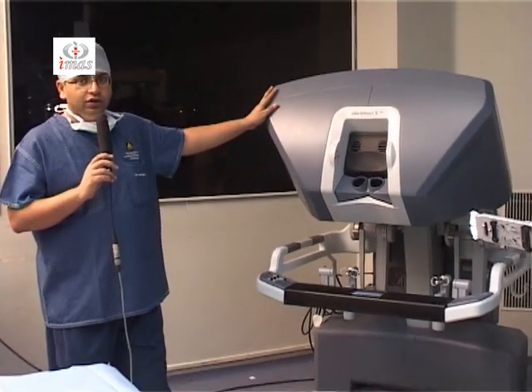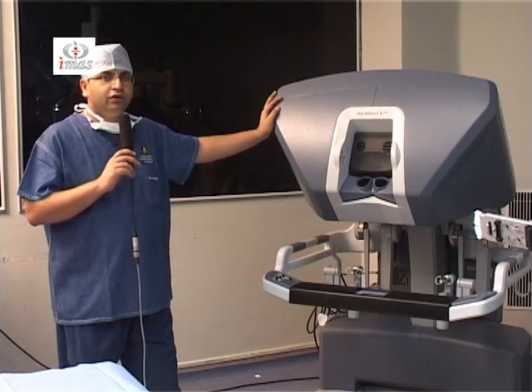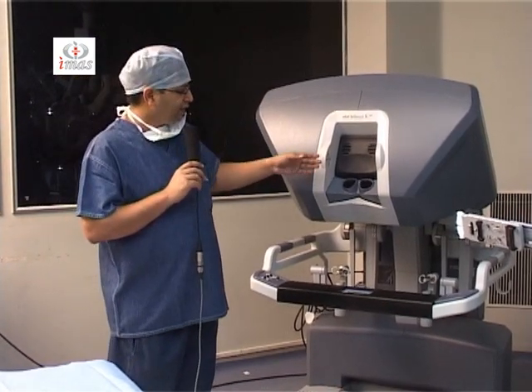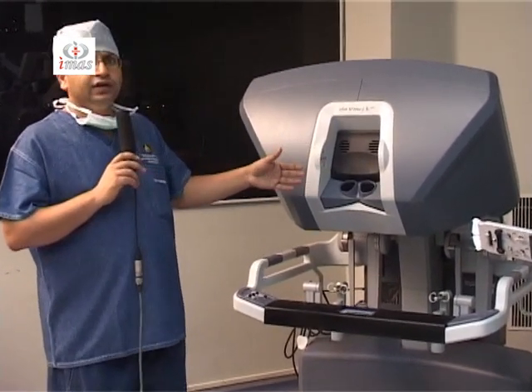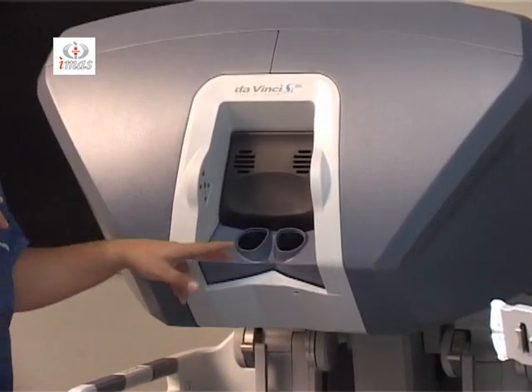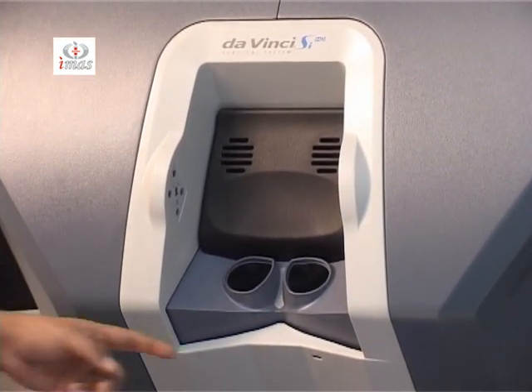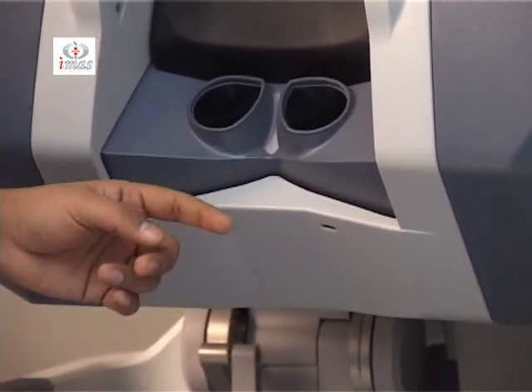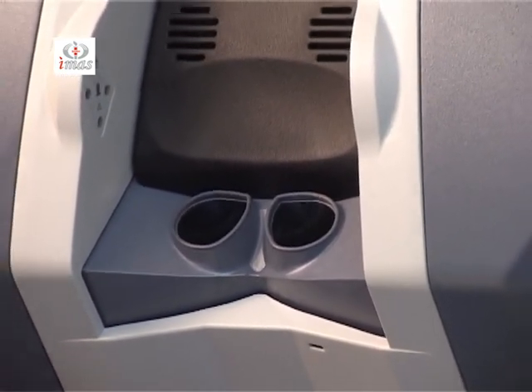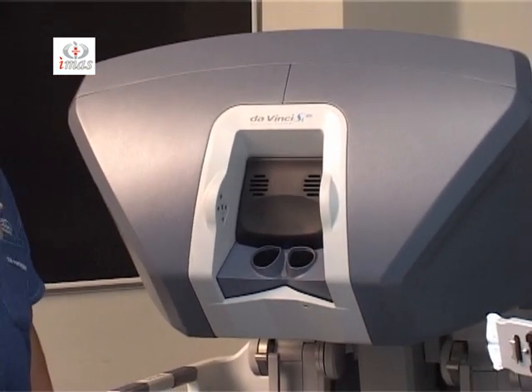This is the master console on which the surgeon sits and controls the movements of all the instrument arms on the patient cart. This consists of various parts such as the stereo viewer, in which the surgeon can see a three-dimensional high-definition view of the surgical field with the help of binocular vision provided with stereoscope. There is a microphone by which the surgeon can speak, and it is listened to by the assistants from the speaker on the LCD screen of the vision cart.